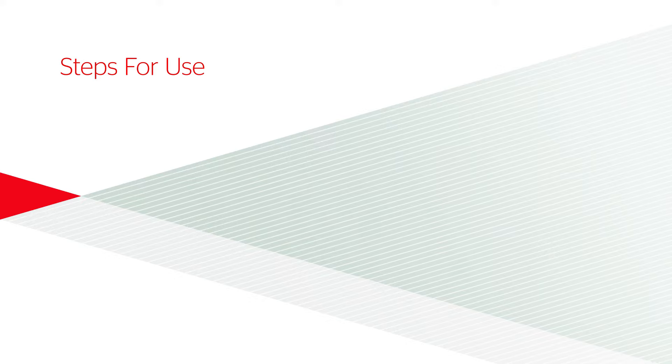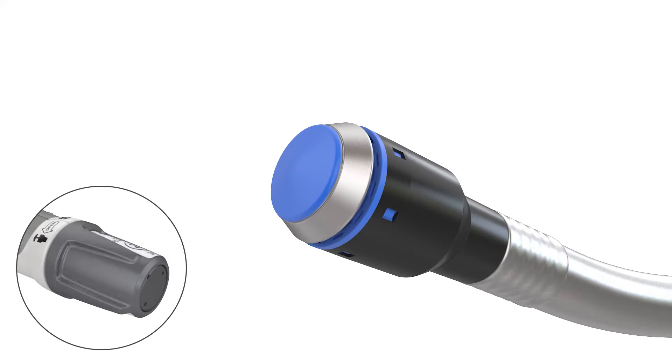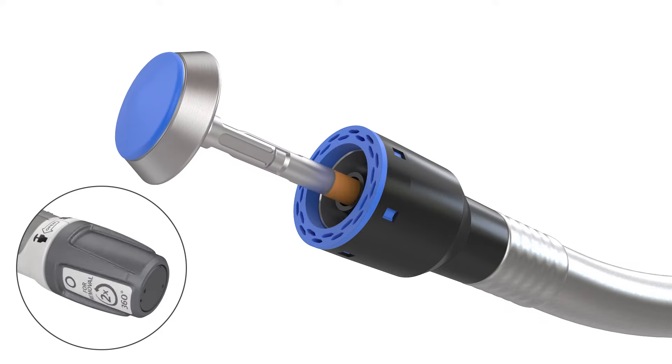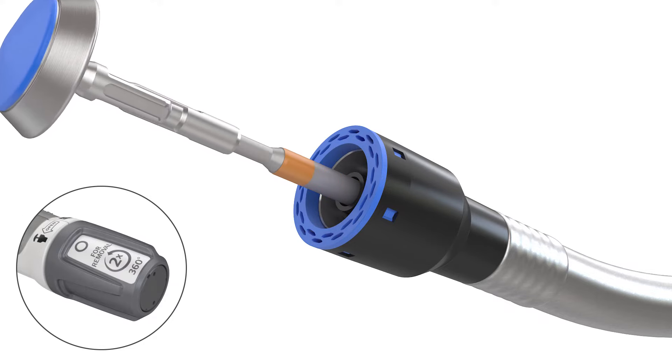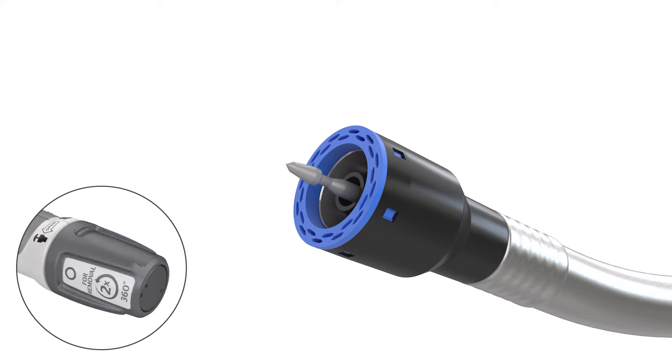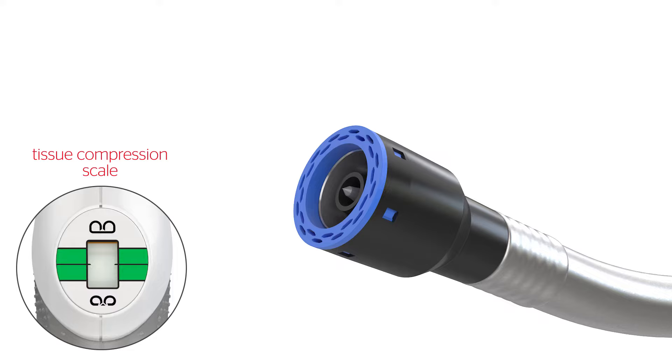Steps for use. Open the device by turning the adjusting knob counterclockwise until the anvil shaft is fully exposed. With the anvil removed, retract the device trocar until it is no longer exposed. Look at the tissue compression scale and ensure the indicator is not in or near the green zone.